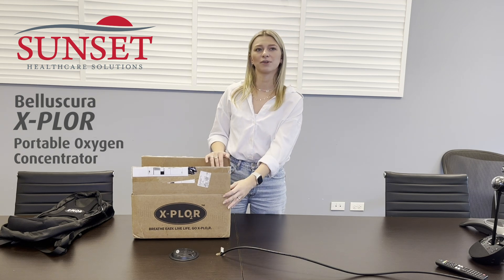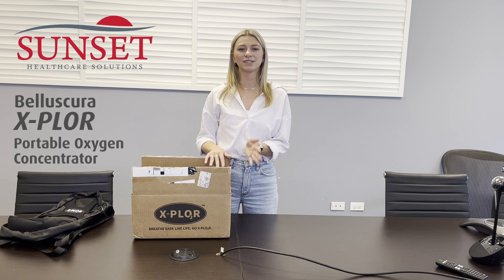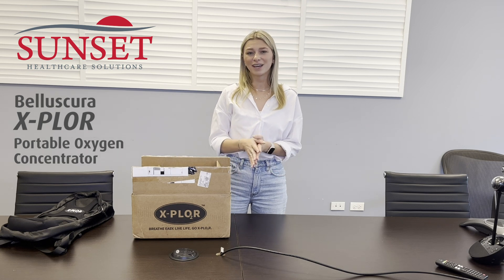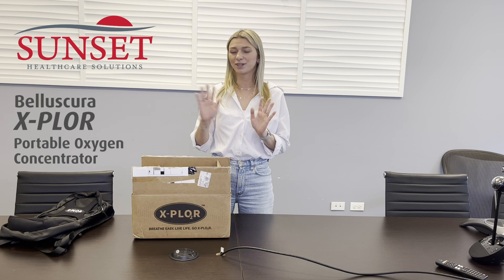This is the Belluscura X-PLOR. It's a 1-4 pulse-dose unit and it weighs a little bit less than 3.75 pounds, making it one of the lightest POCs on the market at this flow setting. It also requires less maintenance than other POCs because it has a user-replaceable sieve bed, which I'll demonstrate a little bit later on how to change.